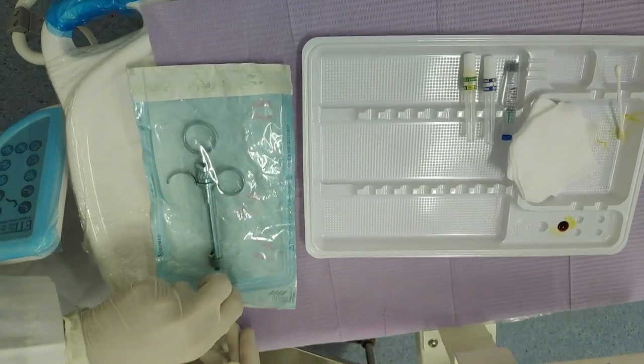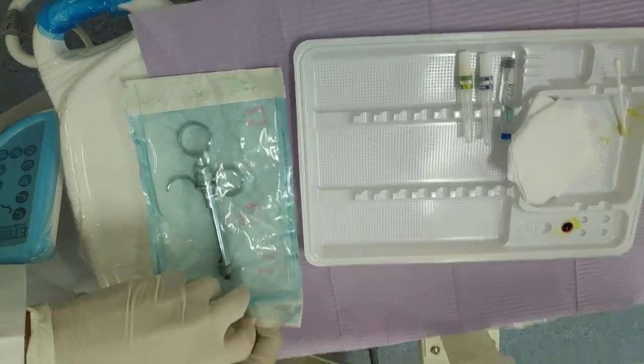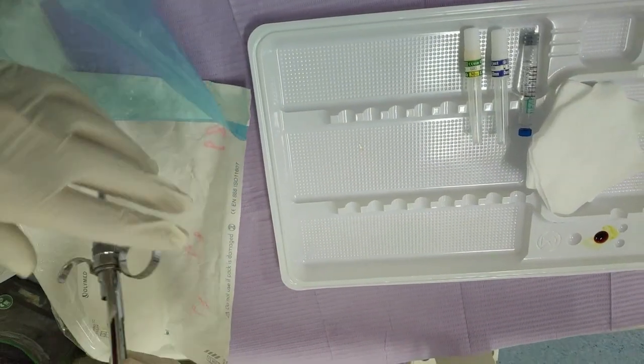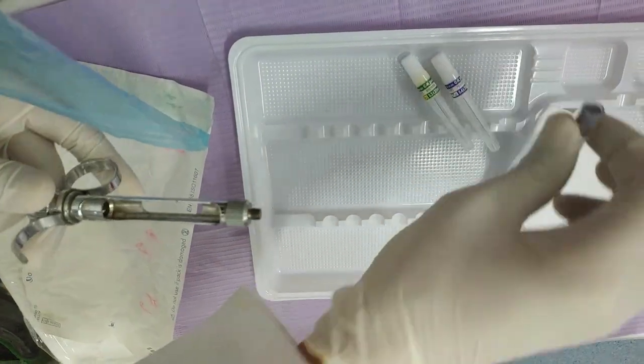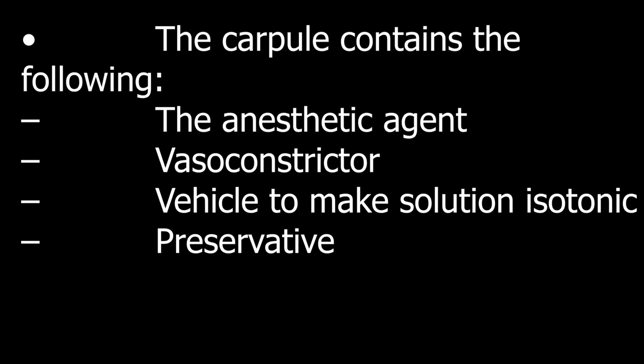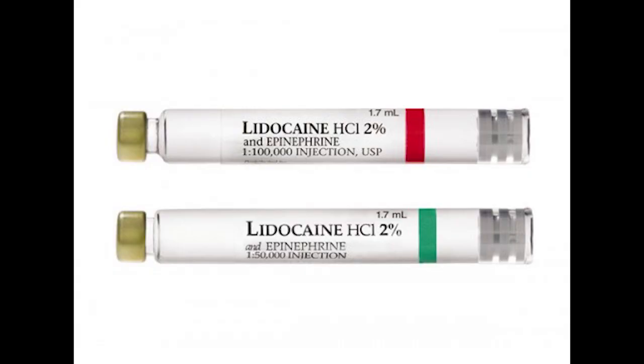Here is how we put these together: the syringe, the needle, and the carpule. There are a lot of parts to the carpule that we need to know. These include the components of the liquid inside the carpule. There are different types of carpules with different concentrations.